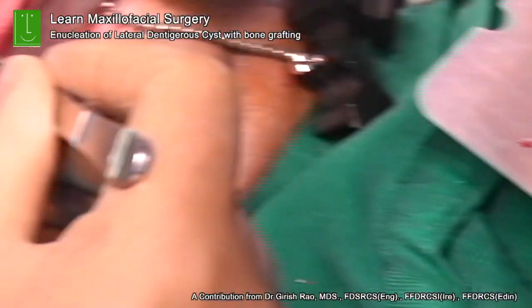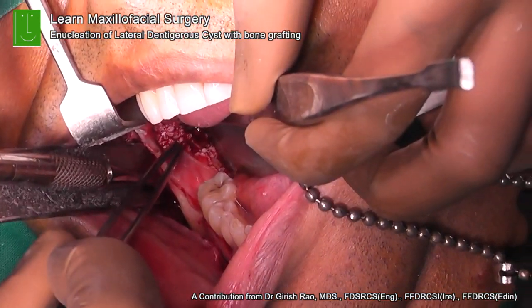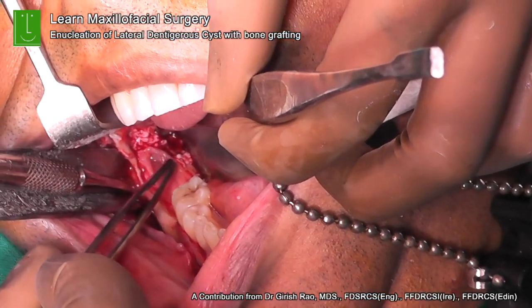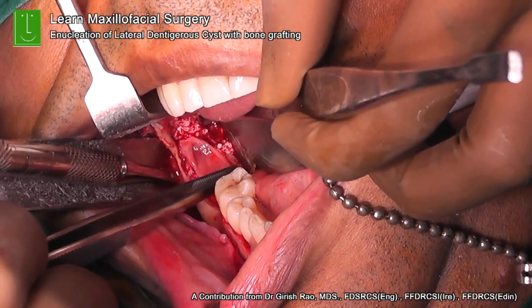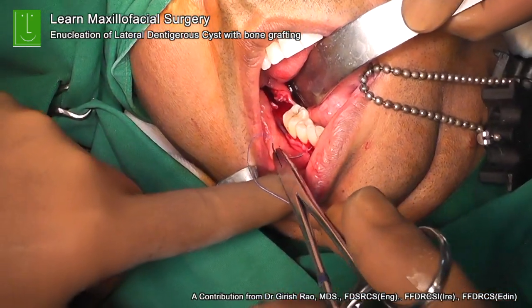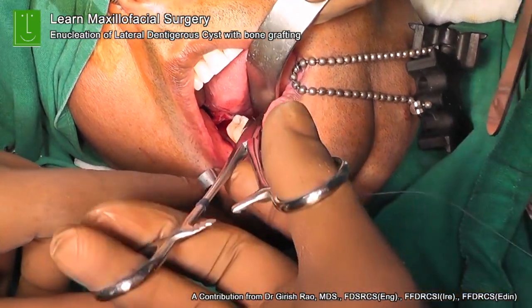Now you have created a membrane with the platelet-rich fibrin, and that is placed above the graft material. You can see the way in which we are laying the platelet-rich fibrin membrane on top, and this helps, as there are so many growth factors in platelets. These are the platelet-derived growth factors, and that helps in early bone healing. The key after you put the graft is basically doing what is called a watertight closure.